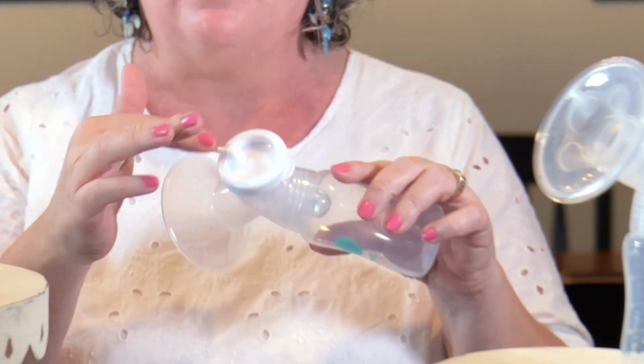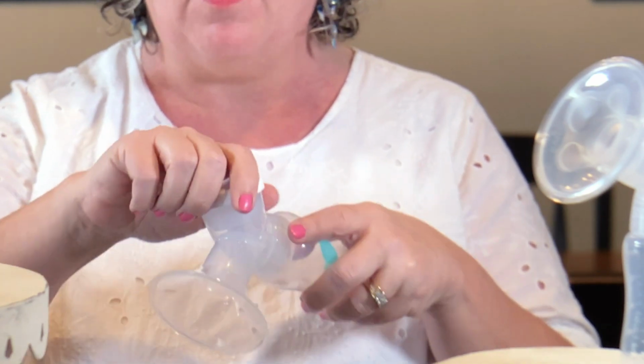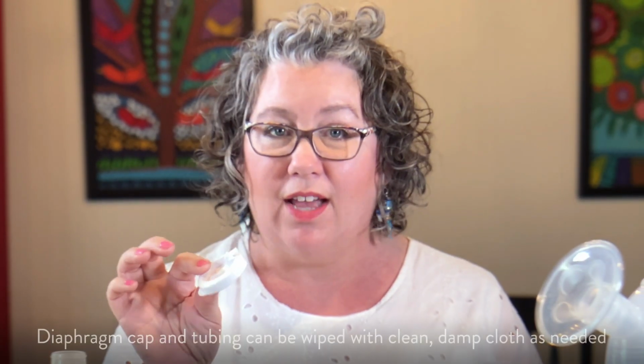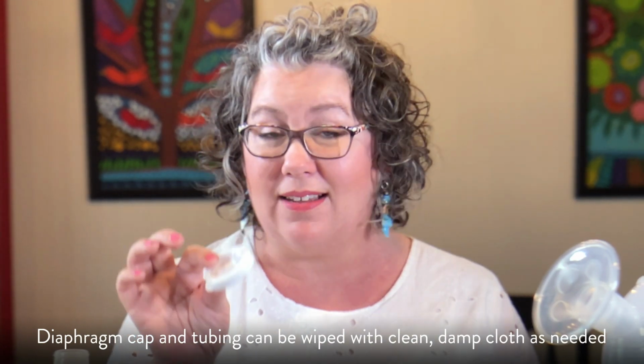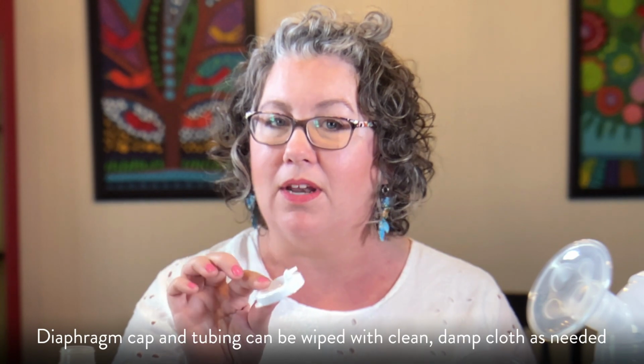Now let's look at the other side of the flange. This is called the diaphragm cap. Using this little rounded edge, go ahead and grasp that with your finger and snap it off. This is the part that your tubing connects to for your collection bottles. Milk never touches this part, so we're not going to need to clean it or sanitize it. So I remember not to clean it, I'm going to go ahead and put it with the pump motor.